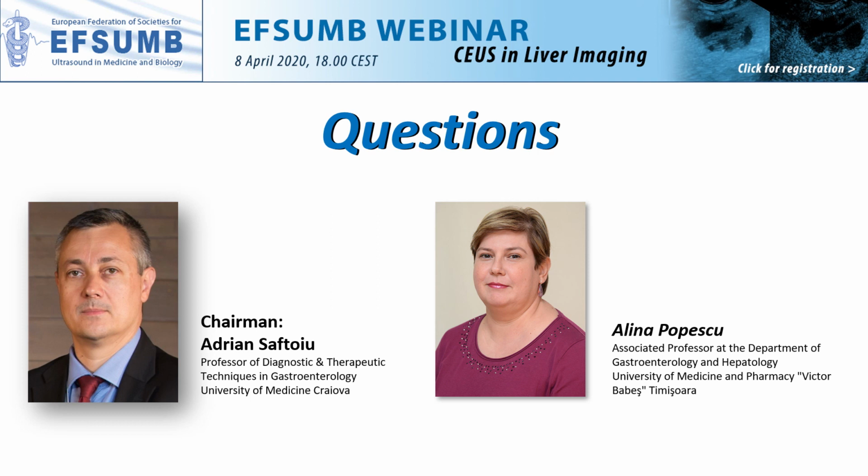Then one last question for all the panelists is, how often do they use quantification? That's the last question. So I can tell you that from my point of view, we don't use quantification so frequently in clinical practice. We use it when we follow our patients after treatment, usually. So this is the most important indication for us, but we use a lot of contrast in daily practice.